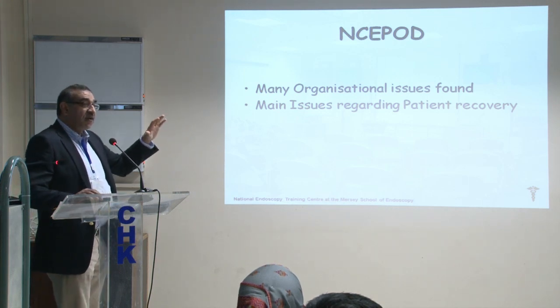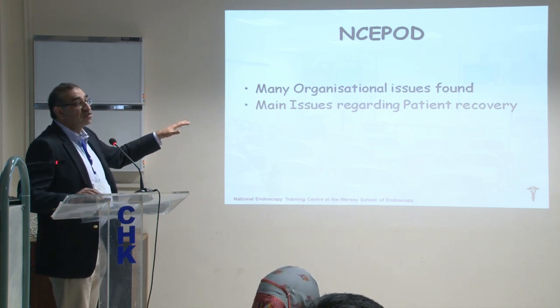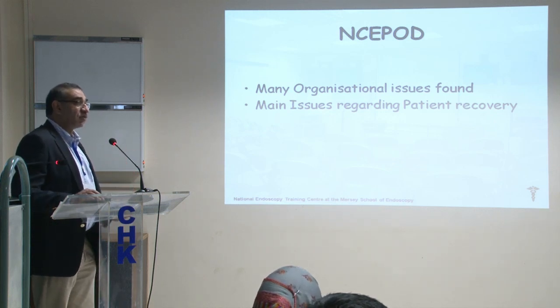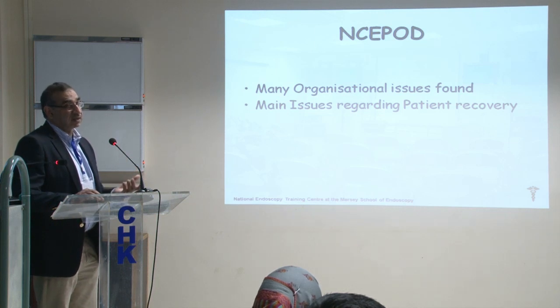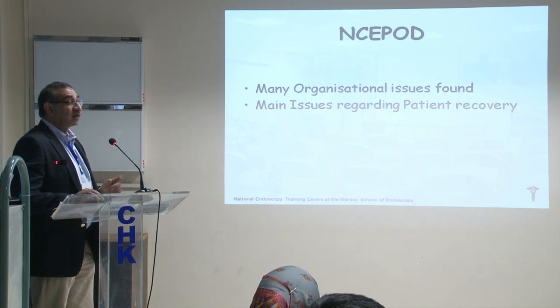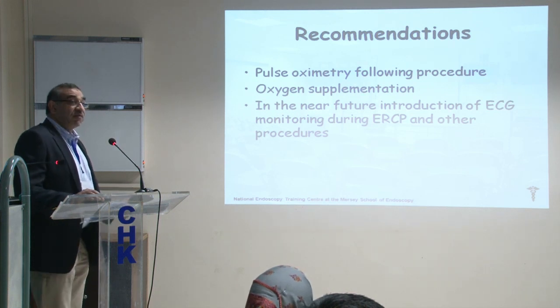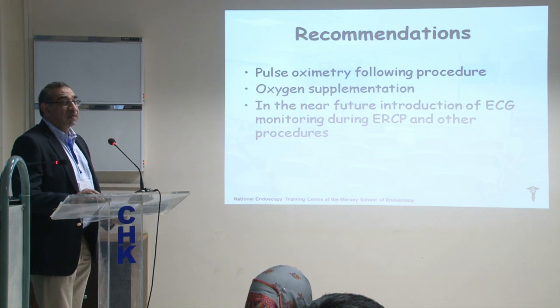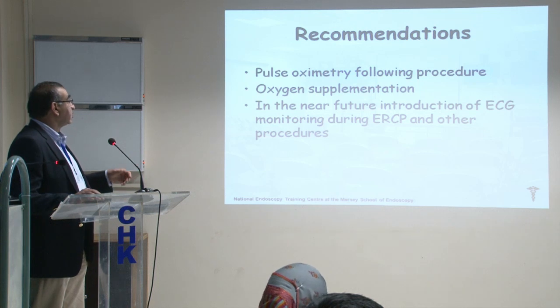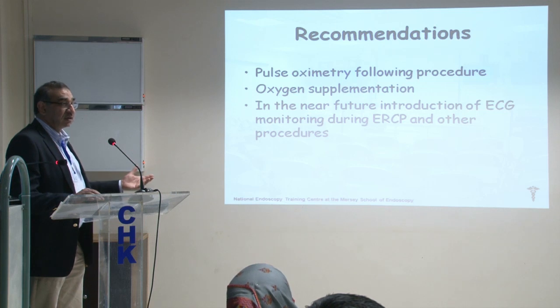As a result of this, it was the first time they looked into the practice of endoscopy. So a lot of issues were identified. And the good thing about those countries is that when they carry out the audit process, they pick up the issues and then they act upon it. That's how you make improvement in your practice. Because as I said, even in the UK, our practice was pretty unregulated, not anymore. And there were some very simple recommendations that were made: pulse oximetry following procedure, oxygen supplementation, and better monitoring, like ECG monitoring and blood pressure monitoring during the procedure.